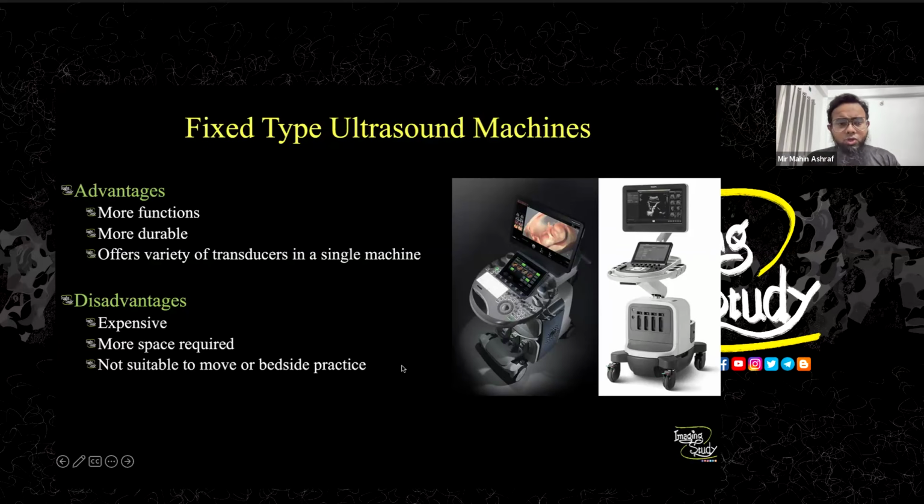Yeah, okay. So the main disadvantage of these high priced machines is that you can't afford it. It's quite expensive. So if you have a small diagnostic or you are trying to start a business of medical equipment, it's very difficult to manage this type of expensive machines. And they obviously take more space and they're not suitable for carrying around.